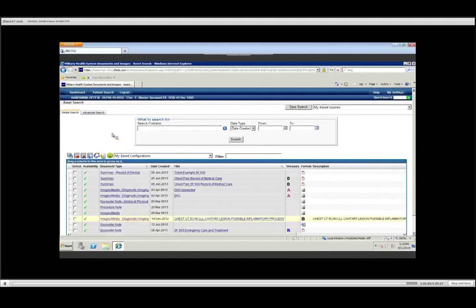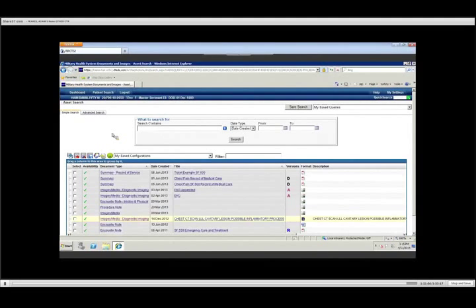Yes, I do have a question on those DICOM images. Since this is a tri-service-wide application, am I going to be able to see Army, Air Force, and Navy images via HAIMS right now? Good question. So the question was asked, because it's a tri-service application for the radiographs, do you have the ability to see all of them, no matter which service generated the DICOM image?